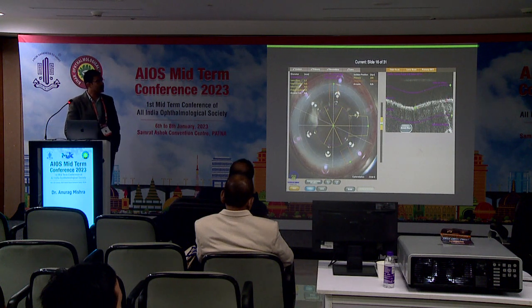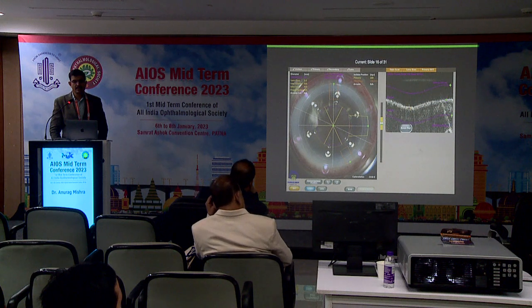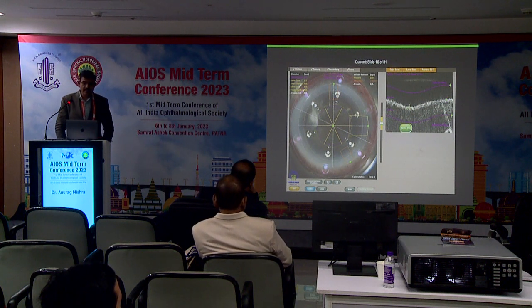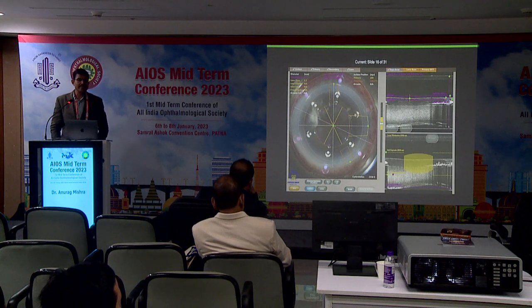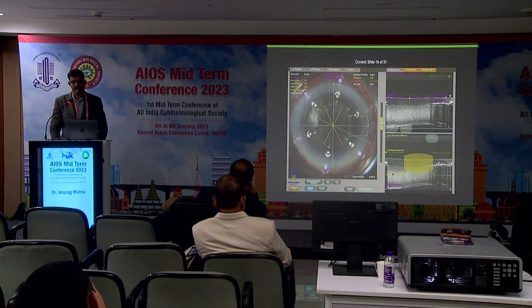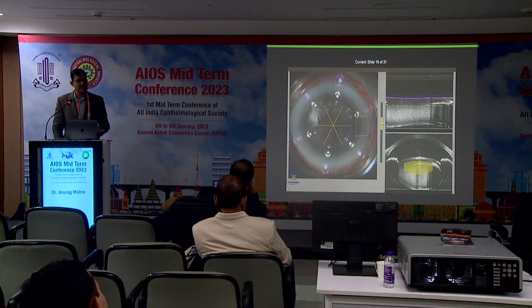The cursors are being placed to identify the highest and lowest points in the anterior capsule. But since the endothelial cell count was low, I decided not to do the nucleotomy too deep. I stayed at a superficial plane. I just wanted the laser beam to give me a cleavage plane so that I know where to crack. But I didn't want the laser beam to travel through and through because I wanted to save on energy, because the endothelial cell count was low.